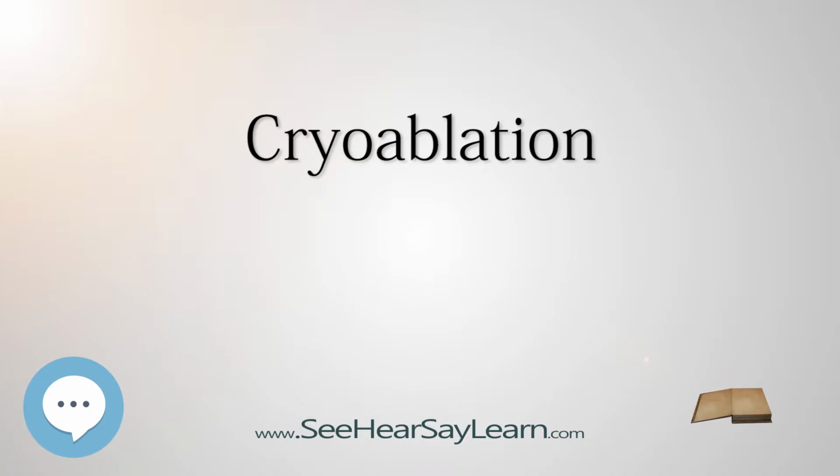The procedure can be performed in a doctor's office setting with local anesthesia and leaves very little scarring compared to open surgical procedures. Catheter-based procedures. Different catheter-based ablation techniques may be used, and they generally fall into two categories. 1. Cold-based procedures, where tissue cooling is used to treat the arrhythmia, and 2. Heat-based procedures, where high temperature is used to alter the abnormal conductive tissue in the heart.